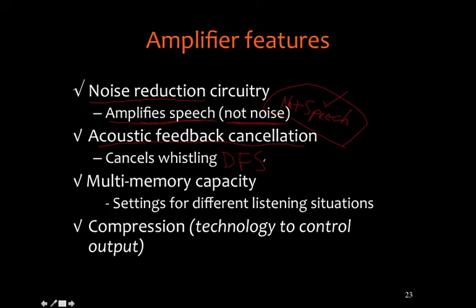It operates a couple of different ways, but in a sense, the hearing aid monitors the signal going out of it, analyzes it, determines what frequency it is, and adds an antiphasic frequency that cancels it. So there's a possibility of cancellation, so that signal's not there anymore.